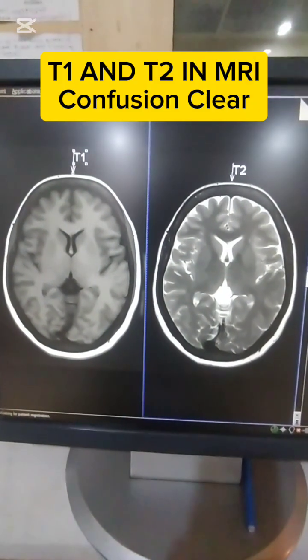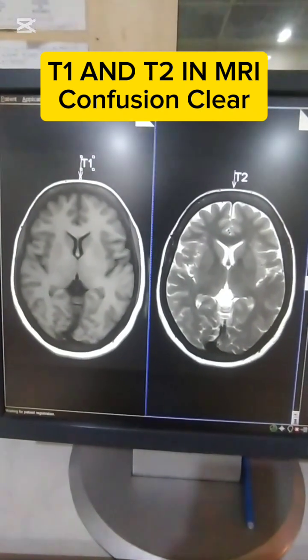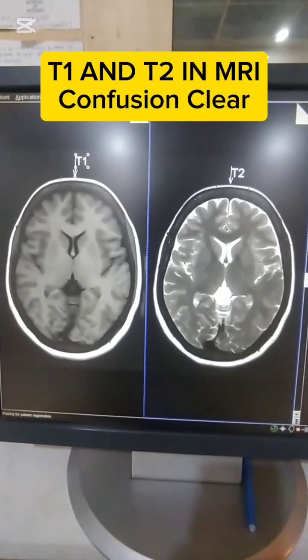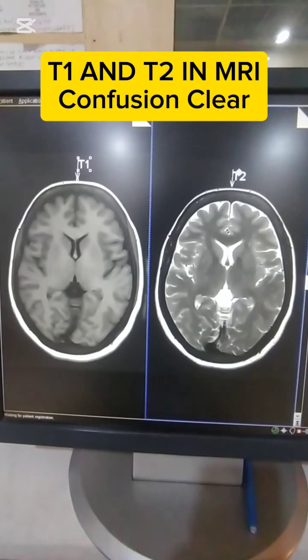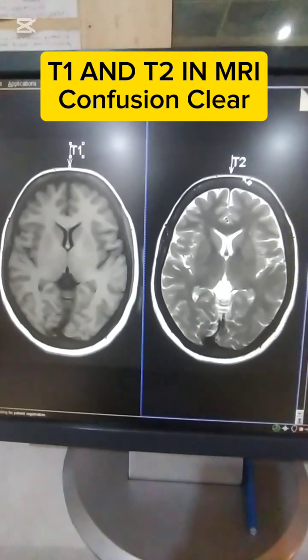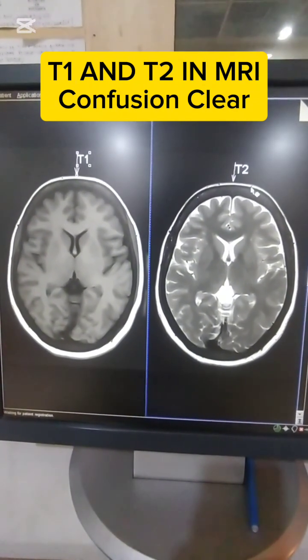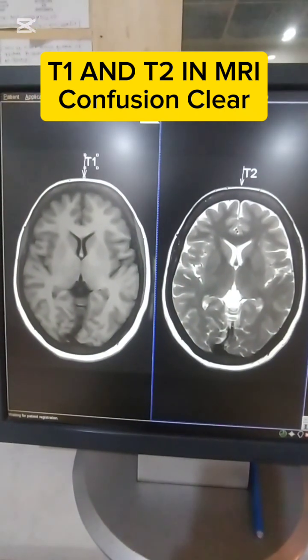What is T2 and T1 in MRI? There is a lot of confusion about these terms, T2 and T1. At first, the letter T comes from time. Always remember that the letter T comes from time. Now, where does the time come from?